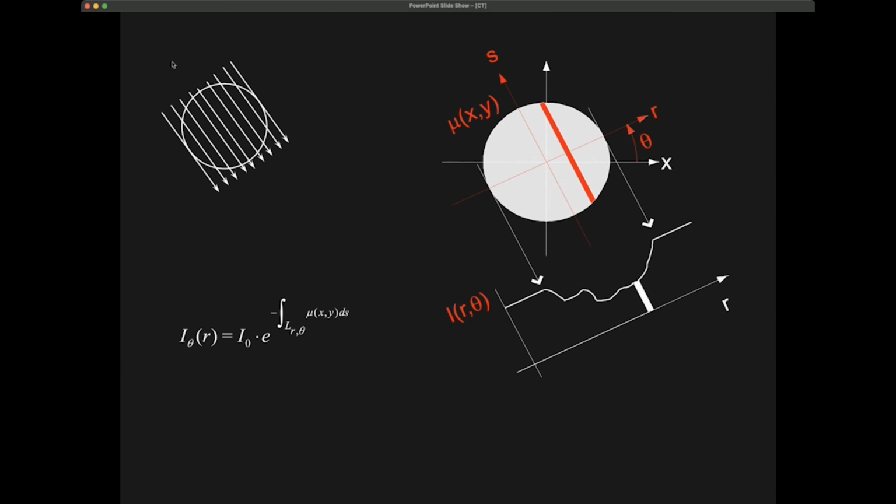Next, as I said before, under the angle that we're looking at, we want the intensities or projections of every line, because we want to cover the whole thing. This is similar to regular X-ray imaging. We want the X-ray passing through the whole body, so we have several lines that the X-rays pass through, and for each of these lines we measure the intensity. The initial intensity was the same for all of these, but the intensity that we measure will be different depending on where we pass through. A typical intensity profile might be here.